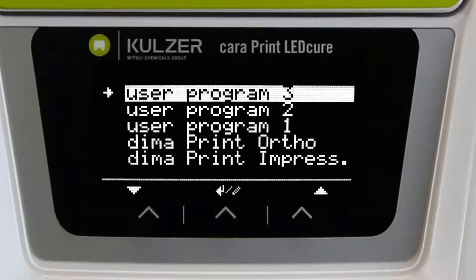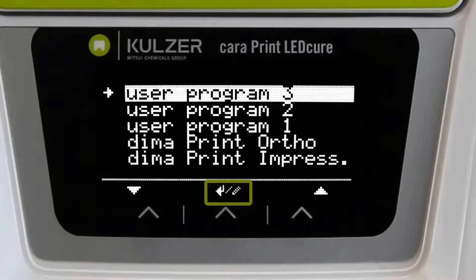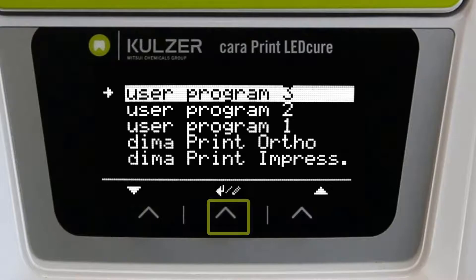The programs that can be freely customized are marked with 'user program'. If this is marked with a pencil and an arrow, customer-specific parameters are already stored. The program can then be selected and started by a short press of the middle button.